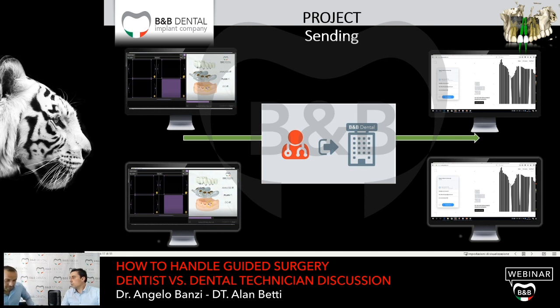Remember that for this trick there is a part of the kit dedicated, with tools with +2 or +4, to allow you to insert the implant in the right position, anyway in the proper position.